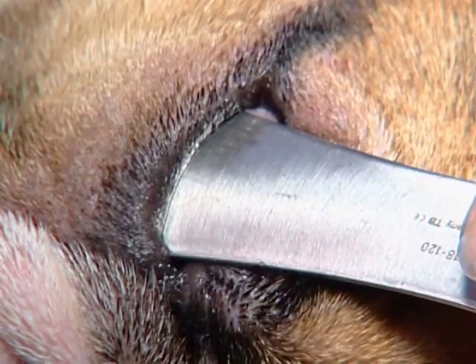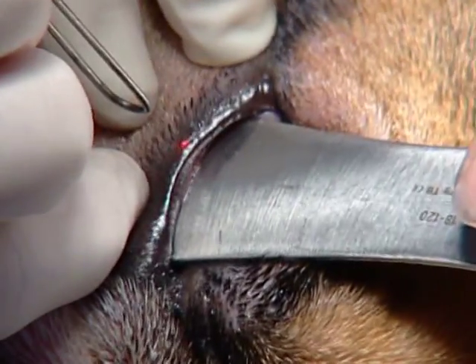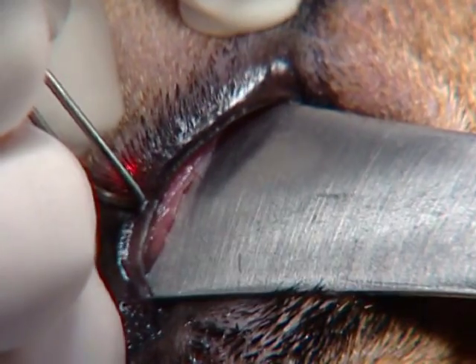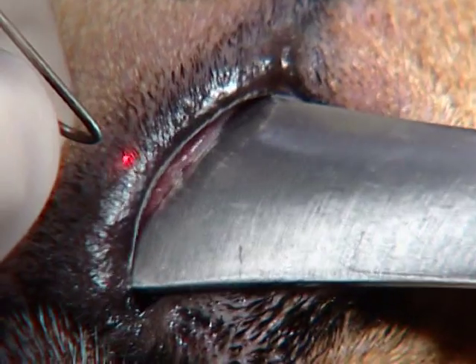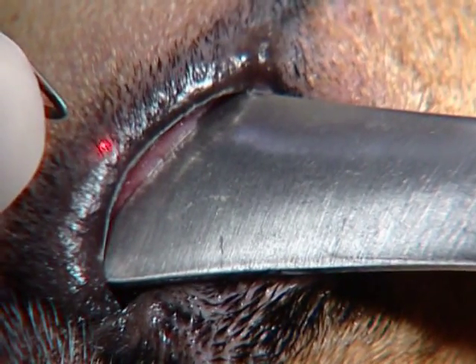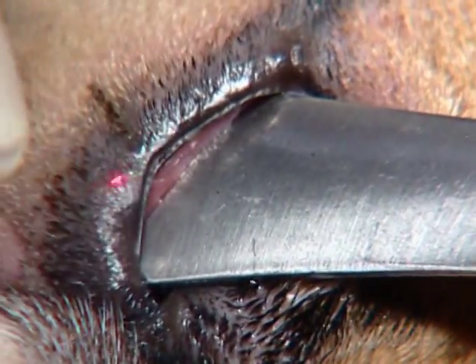That is as much correction as you will get with this procedure. One of my favorite points with cutting edge is the aiming beam — the diode allows me to precisely know where I'm going to start. I'm going to go midway, just like we did on the other eye, but now I'm going to pull back. This would be where I was on the other eye; I'm here now. It's set on two — the other eye, where I was actually cutting, I was set at four. Decreased my power, pulled back, and I'm going to move very slowly.